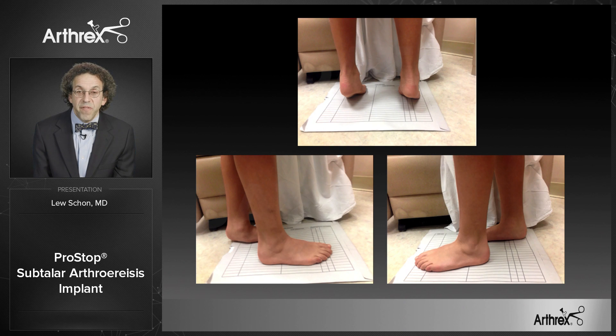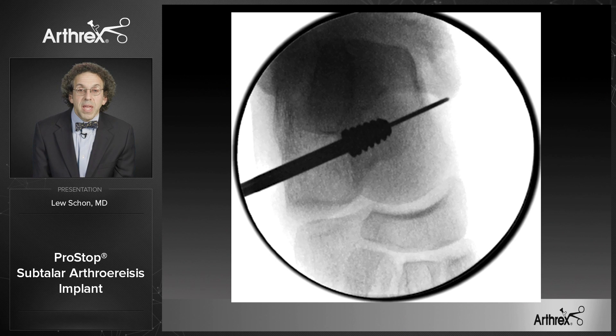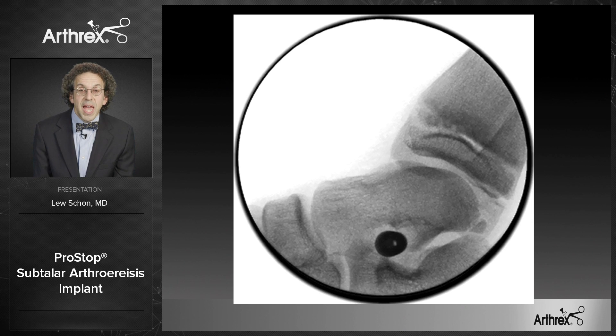We did bilateral PROSTOP implants in one setting. Here you see the guide wire going across the sinus tarsi, out over the sustentaculum talus. Then we inserted the sizer, and you can see the lateral edge of the sizer was just medial to the lateral side of the talus; the lateral view confirmed it did not cross the midline. After removing the implant screwdriver, the screw remained in proper position. Removing the guide wire confirmed the implant stayed in position about 50% across the neck, with the lateral aspect just medial to the lateral shoulder of the talus. The lateral view shows the implant properly positioned in the sinus tarsi.